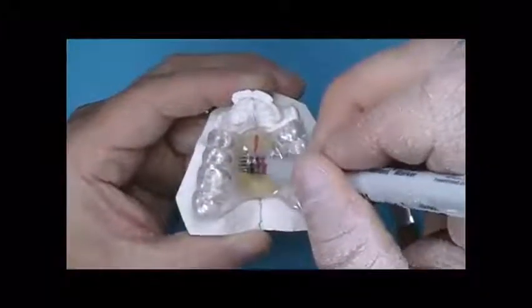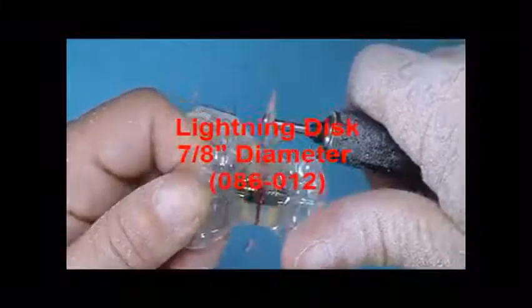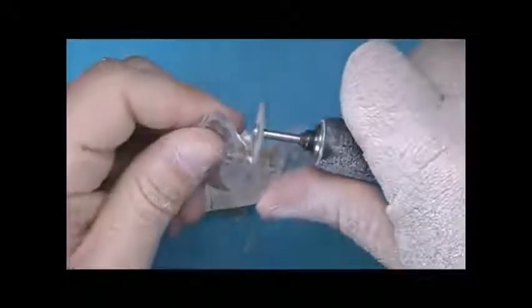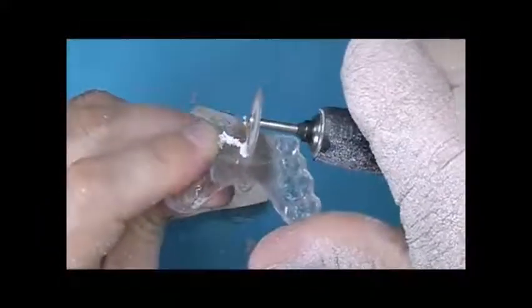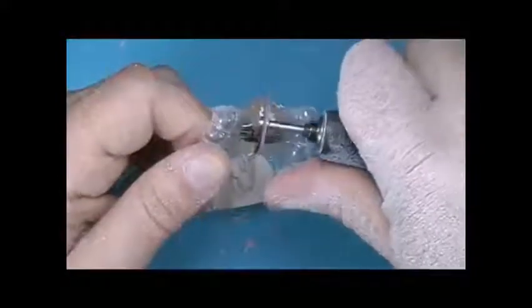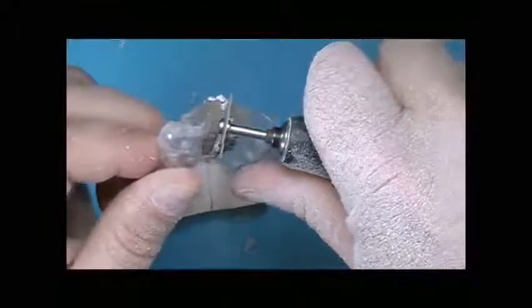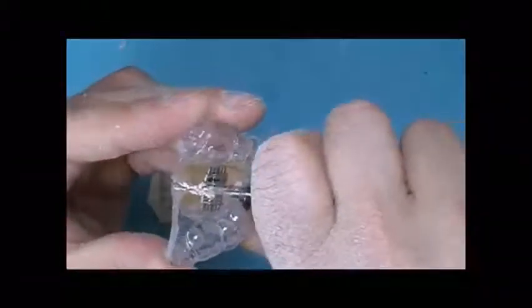A reference line is drawn on the plastic through the center of the screw to locate center cut. This line should also follow the mid-palatal reference. A 7/8 inch diameter lightning disc is used to cut into the center screw reference. Make sure to cut plastic and not metal screw body. Then use the carbide cutting burr to expose center keyhole of screw.